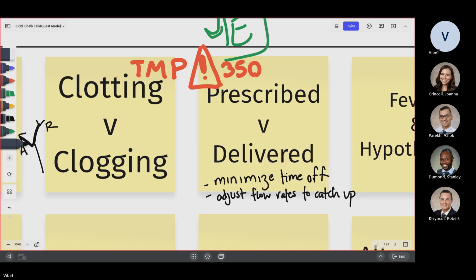So that is the whole concept here: we want to get an adequate treatment for the patient. So it's up to you. And you don't need to call us for everything, especially for our group. You don't need to keep on informing us, oh, I'm going up, I'm going down. It's a range, and the nurses can also play with it, so long as you're achieving the goal we are aiming for in the patient.